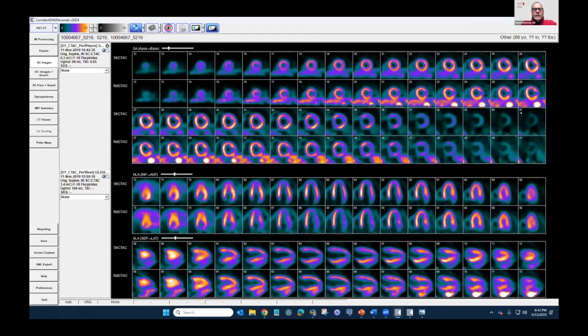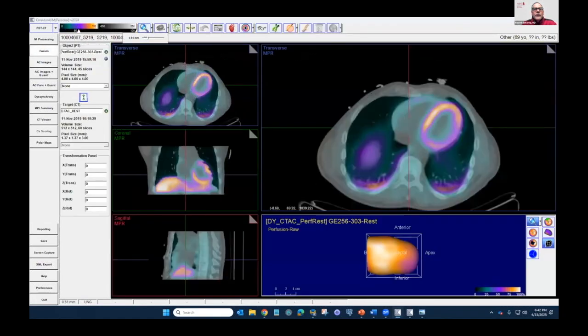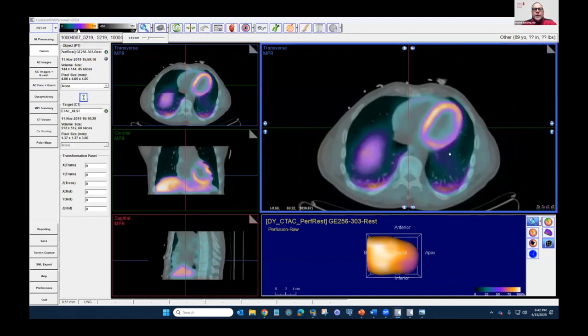And the last point, relating to what you described on the characteristics of the CT itself, if you're doing a slow CT on a scanner with not many slices, it's very important to give instruction for shallow breathing to the patients.